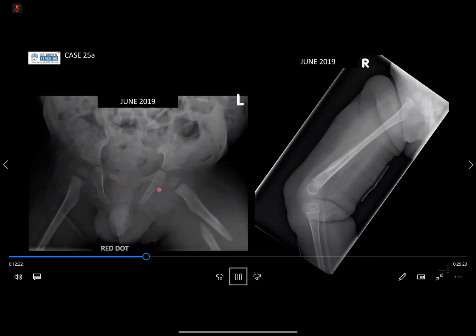Okay. Next case. This is a difficult case. You can ask me questions or I might give you hints. We've got a series of studies. It's a story case. Have a look at the first X-ray. Just tell me what you see, but don't give me a differential first. Then I'll show you other images.